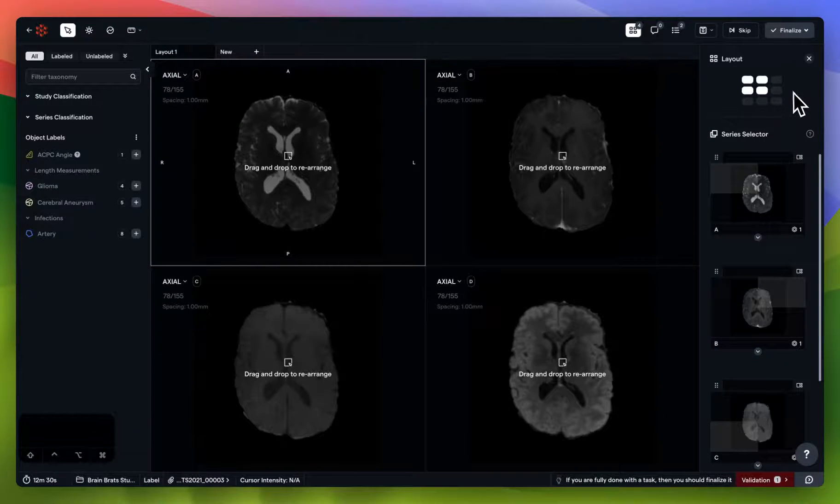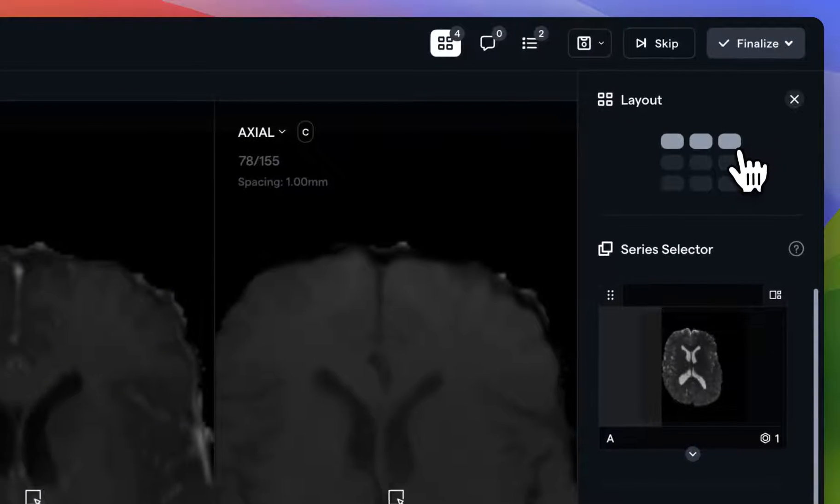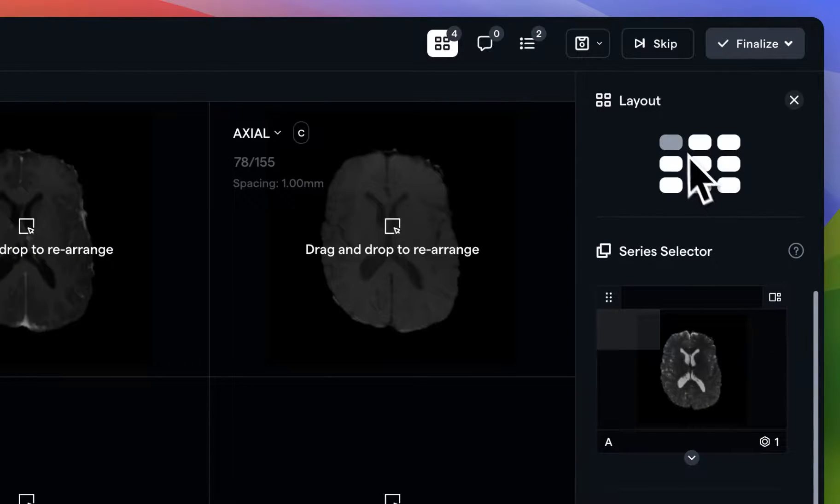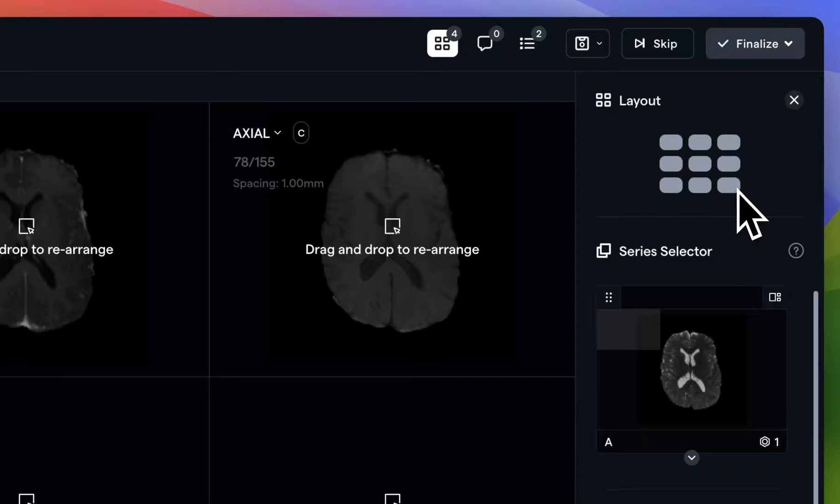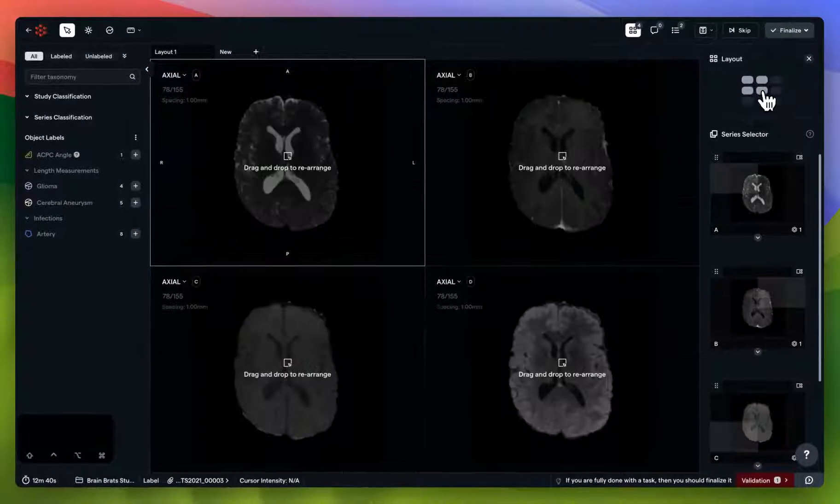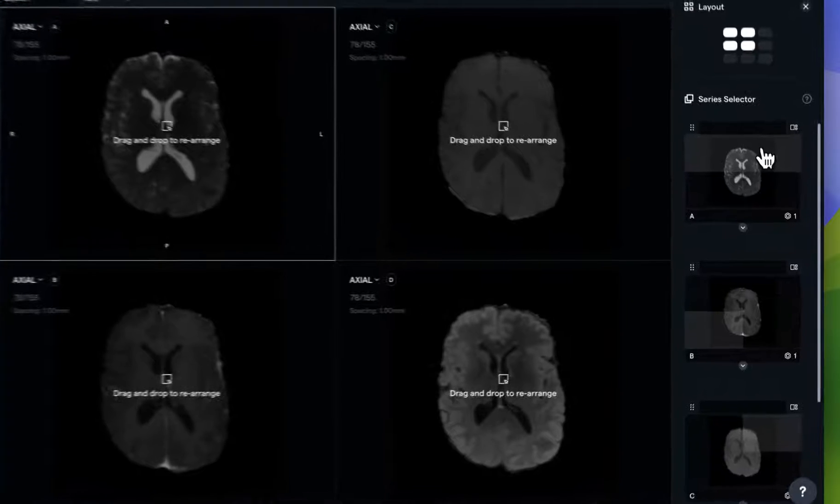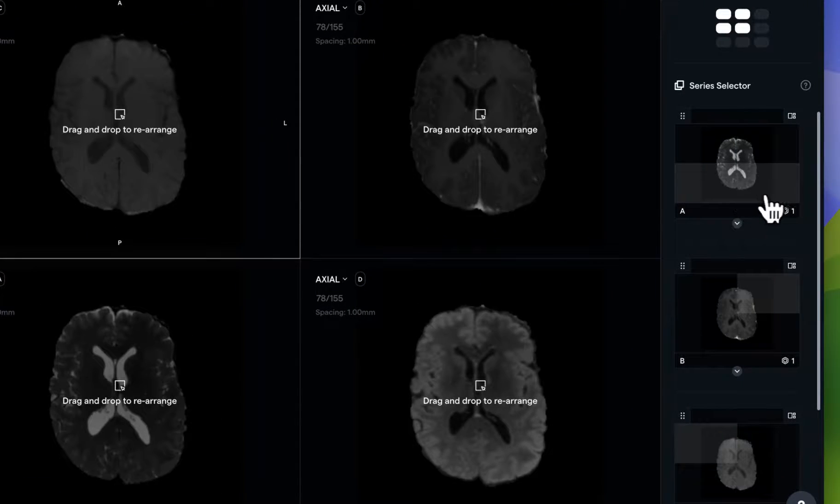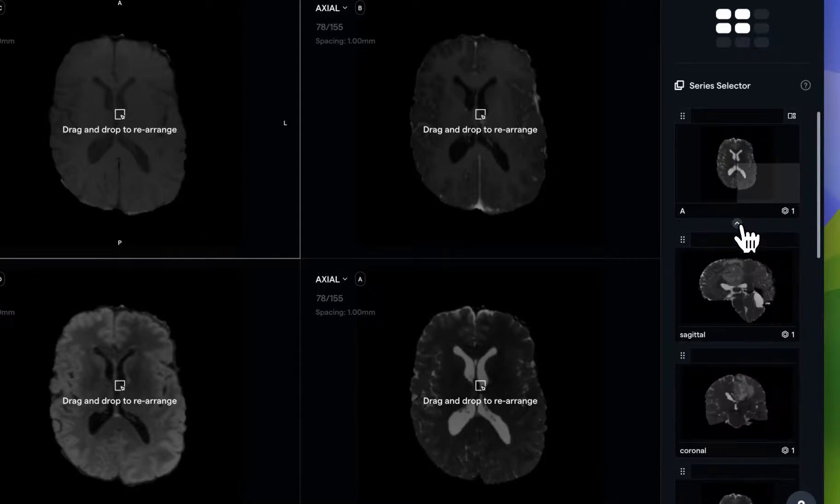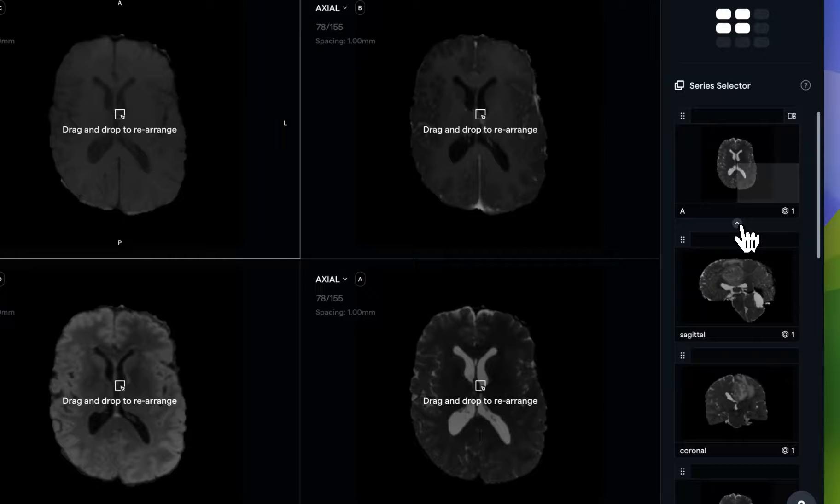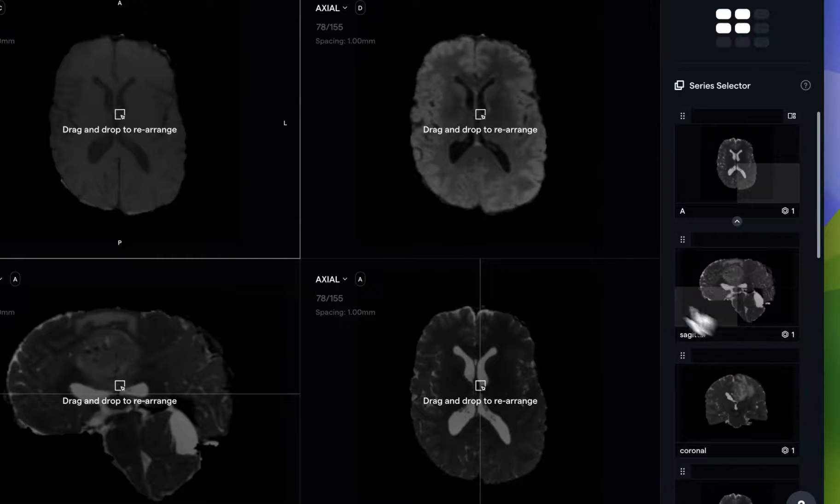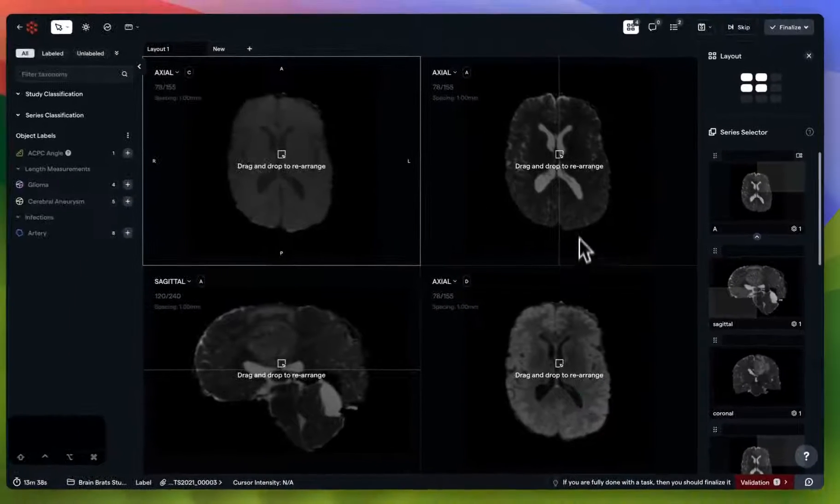At the very top, you have the ability to configure your layout tab as best suits you using any combination of between one-to-one and three-to-three views. You can also use the series selector to quickly rearrange your views. Please bear in mind that you can expand or collapse any individual series to access the projections, and all of these windows can be easily dragged and dropped to rearrange.